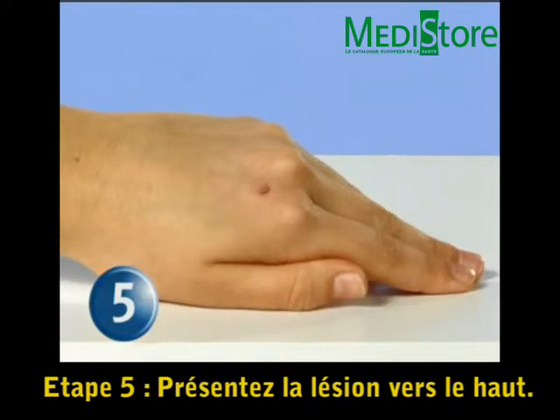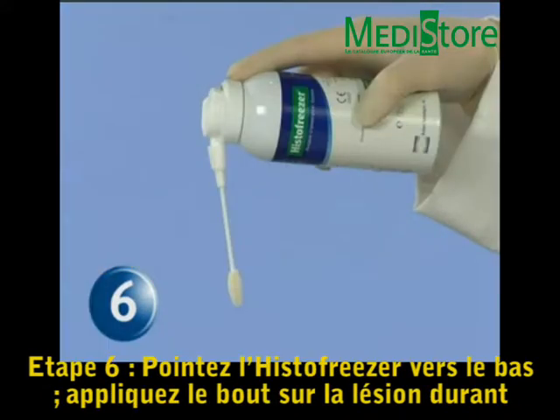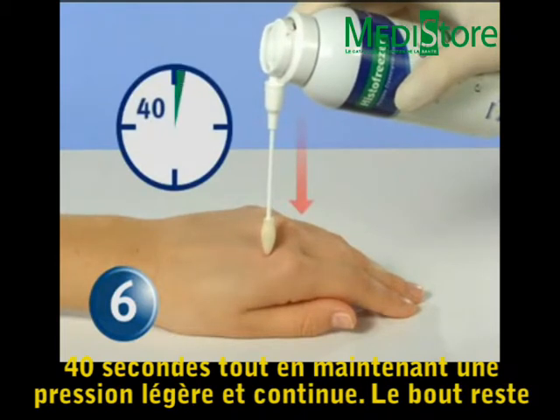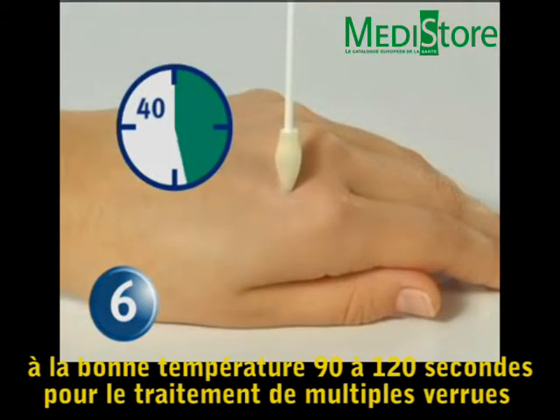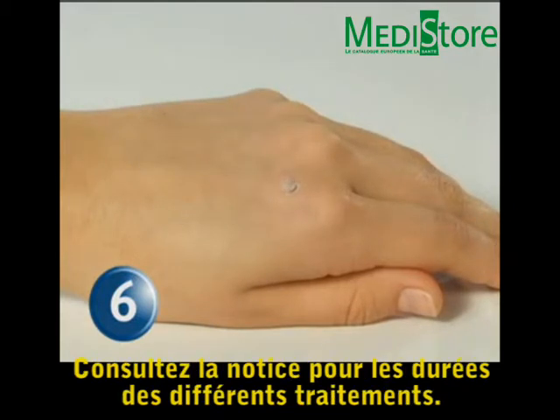Step 5: Face the wart in an upward position. Step 6: Point the HistoFreezer applicator straight downward and apply the tip to the wart for 40 seconds using a slight and continuous pressure. The tip remains at the effective temperature for 90 to 120 seconds for treatment of multiple warts on the same patient with one properly saturated applicator. See the HistoFreezer instructions for use for lesion-specific treatment times.